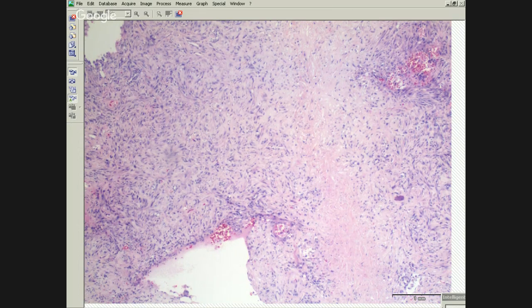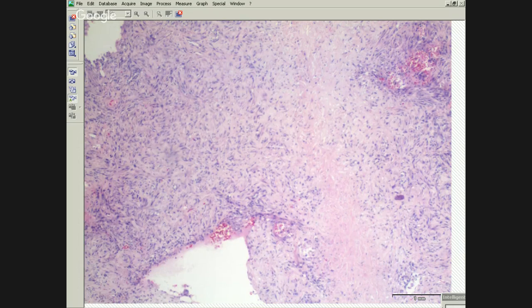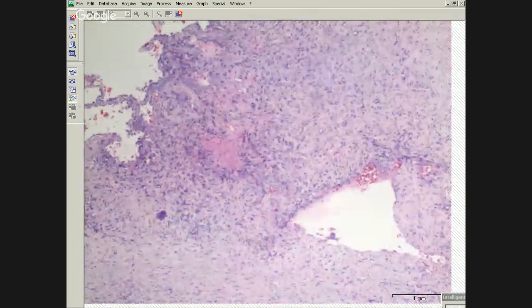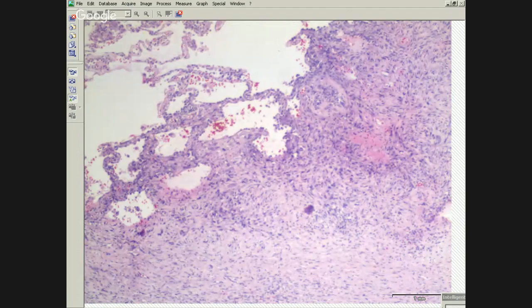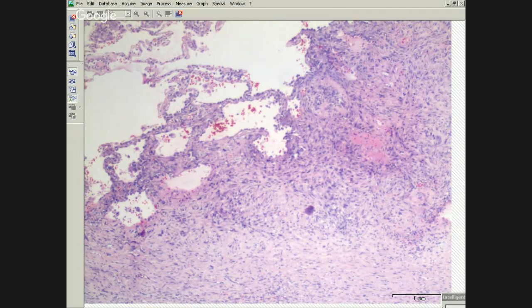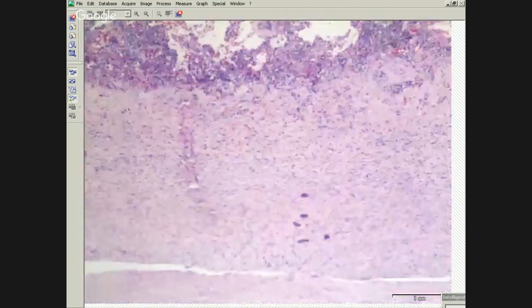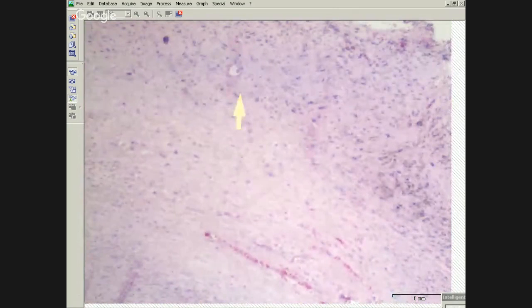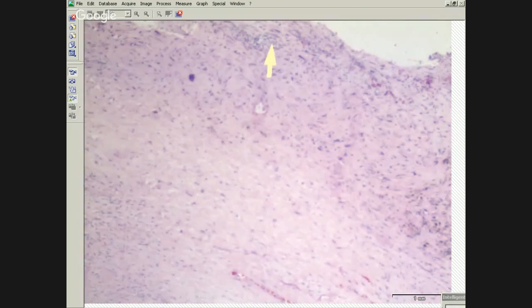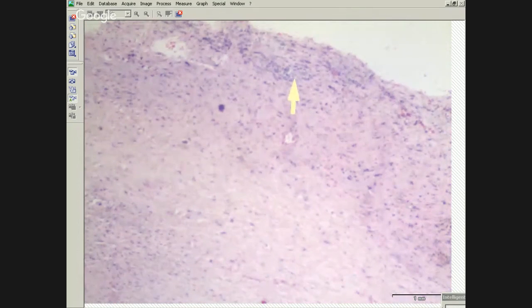But that's basically it. So if you got something that's keratin negative, you want to be really careful. Consider other sarcomas. Consult your favorite soft tissue pathologist. Pitfalls, sarcomatoid meso can be positive for actin on occasion, so that can be confusing with metastatic leiomyosarcoma. Usually the actin staining in mesothelioma is very focal and wimpy compared to leiomyosarcoma though, but you want to be aware of that pitfall. And so this one you would call sarcomatoid. This one has some areas like this, which I pointed out, very low cellularity in this fibrotic background. So it's starting to get what's called a desmoplastic appearance here.